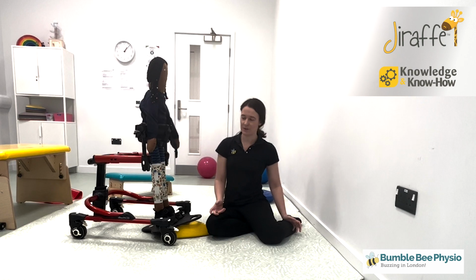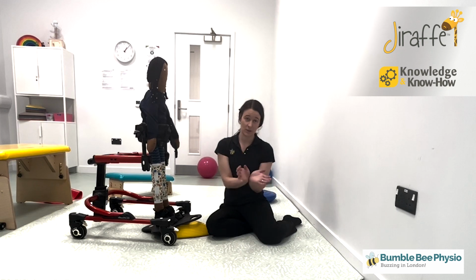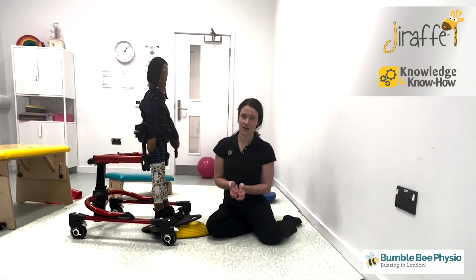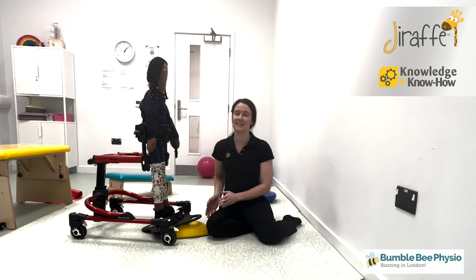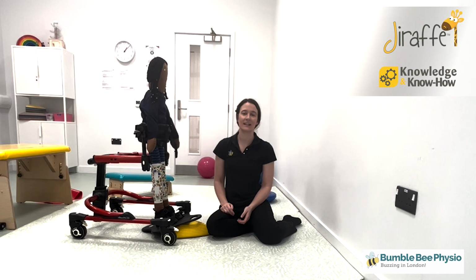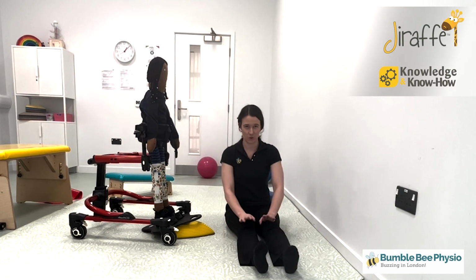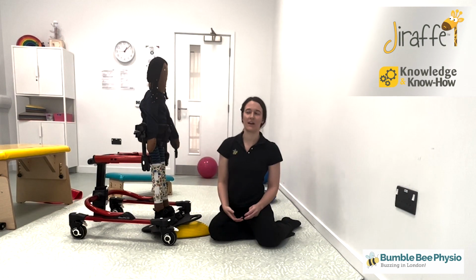Now, the issue with this muscle is that when the gastrocnemius is tight, lots of the time people think AFOs. They think that a pair of AFOs that does the dorsiflexion will stretch out the gastrocnemius. And actually it doesn't, it just stretches out the soleus. To stretch out the gastrocnemius, which is a biarticular muscle, we need dorsiflexion and knee extension. So unless somebody is sitting there with their legs out straight and their AFOs on, they're not having any calf stretch whatsoever. Unless only their soleus is tight, which is very unlikely, because usually single-articular muscles do not become tight.